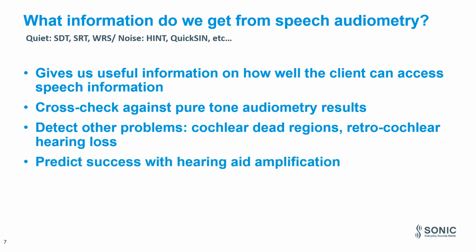Finally, doing speech audiometry helps you predict how successful the hearing aid amplification will be for your client and how well they will be able to hear with their new hearing aids. Based on how good or how bad the speech results are, you can then use this information to set realistic expectations during counseling.